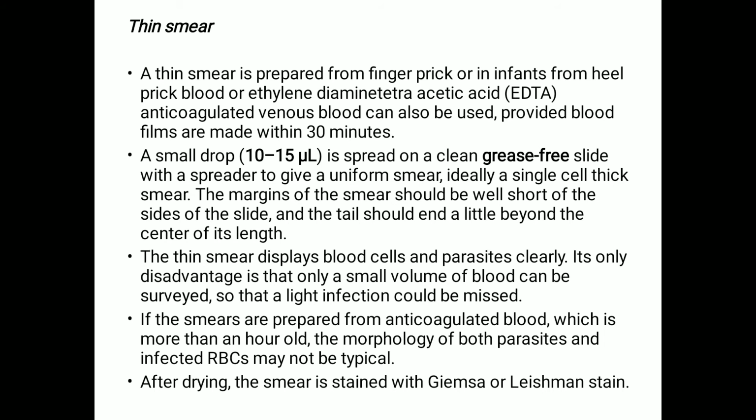Then this smear displays blood cells and parasites clearly as compared to the thick smear. Its only disadvantage is that only a small volume of blood can be surveyed, so a light infection could be missed. Then if the smears are prepared from anticoagulated blood which is more than an hour old, the morphology of both parasites and infected RBCs may not be typical.